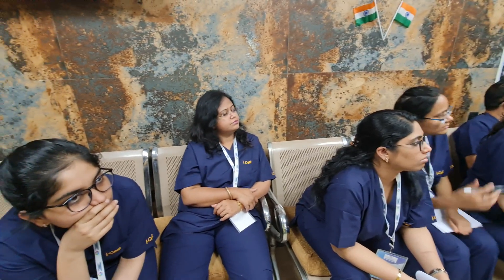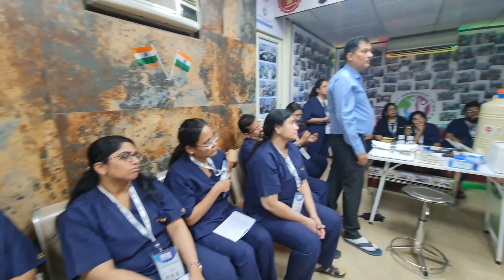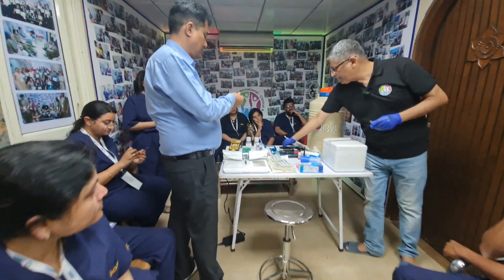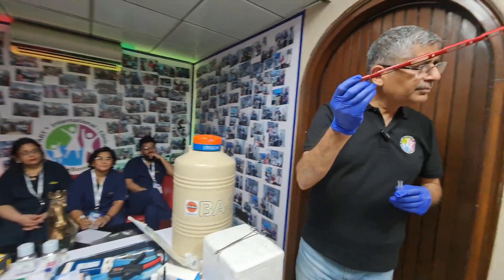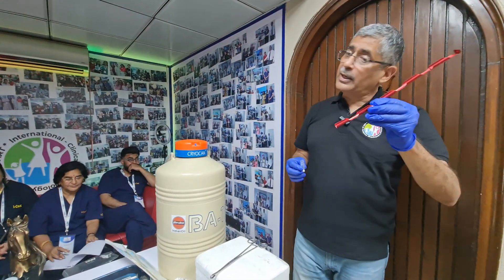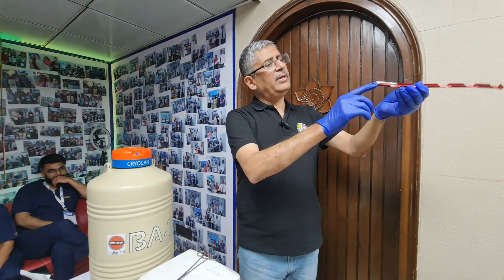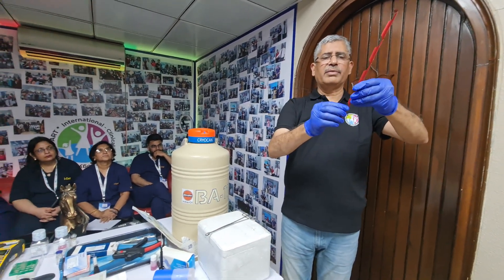What we do here is fill the semen sample in, then we seal it using a sealer like this. After sealing, we use aluminum canes — they fix like this. We also have barcoding here, so we just scan to identify the patient.